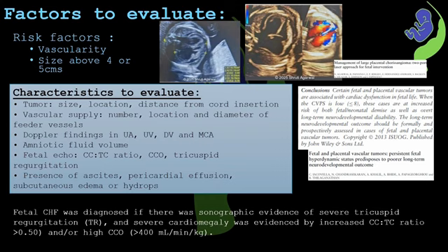The next step is to map the vascular supply. You need to document the number of vessels and location of the vessels, like whether it is single central or multiple or peripheral, like that. And then you have to even document the diameter of the feeding vessel. The clinical significance of this we will see later. So all these parameters will reflect the shunt burden in the chorioangioma.